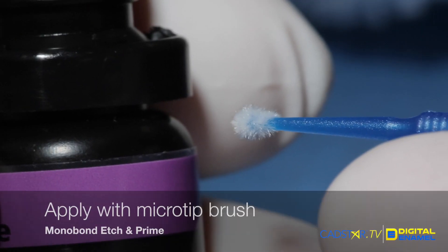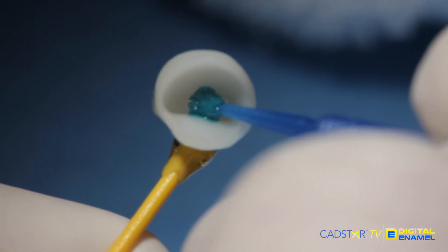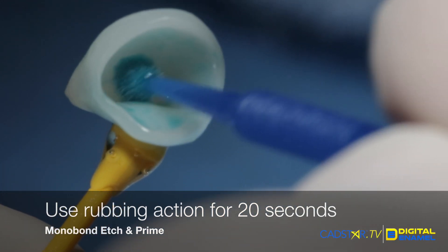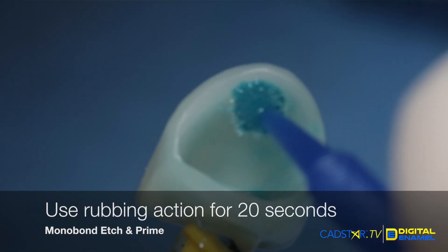All you need is a micro-tip brush. When you're ready to apply the etch and the primer — which is all in the same bottle — you'll load your micro-tip brush. Apply to the internal surface where you want your ceramic to be etched. Don't go over the edge, though — you don't want to etch the outside of your restoration, because it's going to take a little more work to clean up the cement.